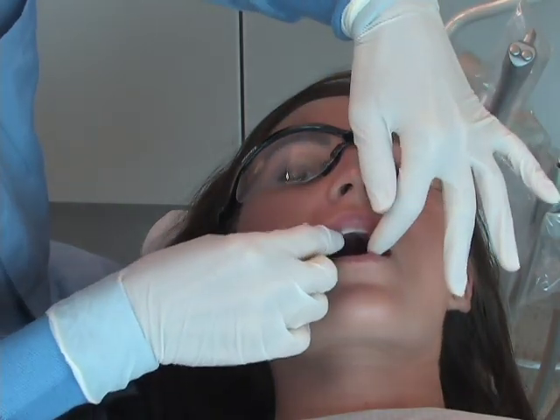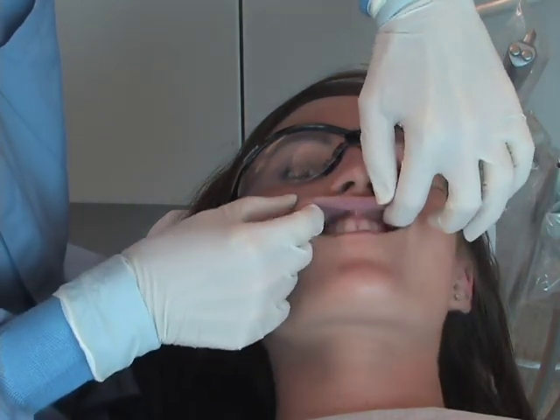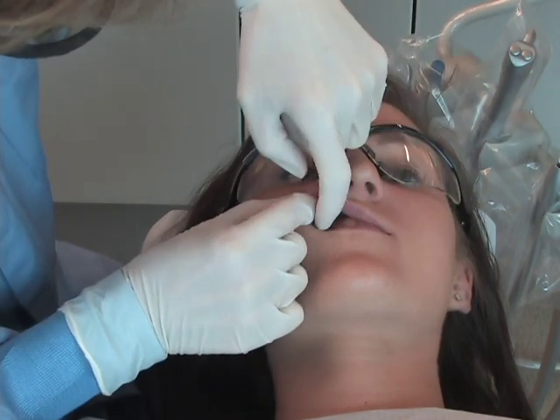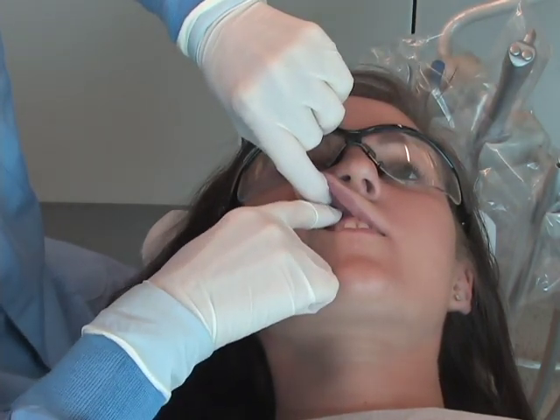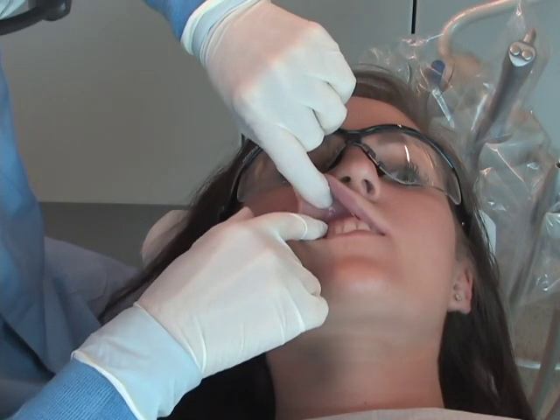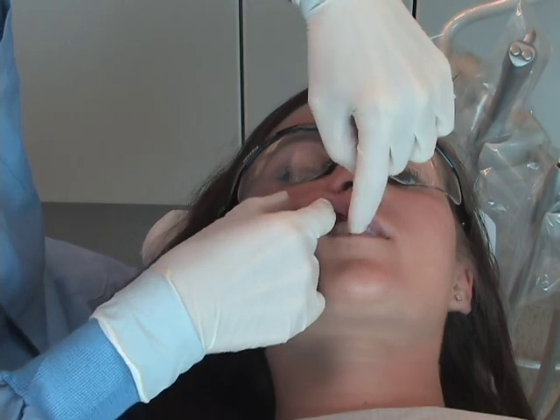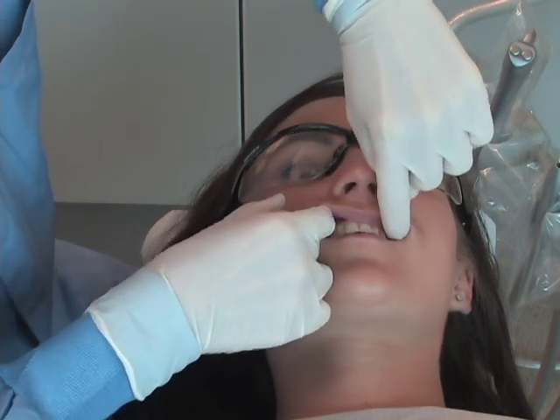Locate and palpate landmarks. Because of individual anatomic variation, it is critical for clinicians to palpate the appropriate landmarks prior to inserting the needle for any injection. Adjustments in technique are made according to the size and shape of the skull, location of foramen, and height of vestibule.